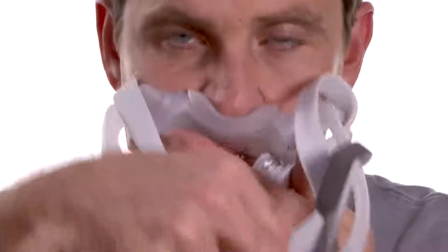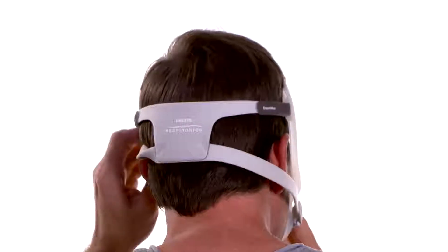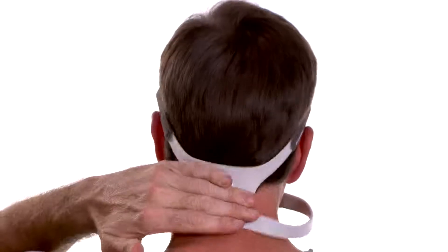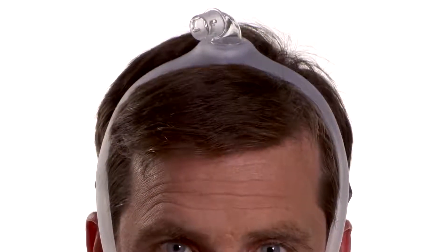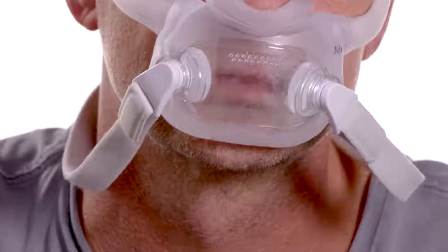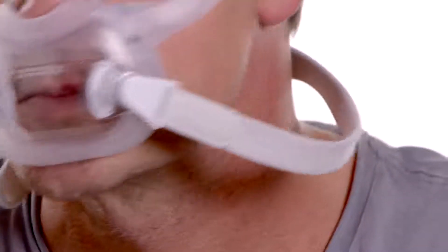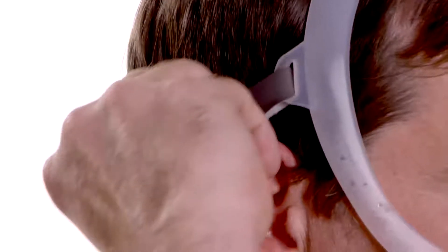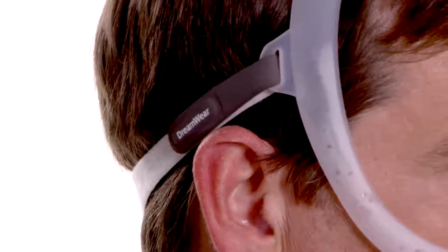To put the mask on, hold the cushion under your nose and pull the headgear down until it sits across the back of your head. Position the mask frame on the top of your head. Be sure the magnetic headgear clips are attached to the mask cushion. Peel the headgear tabs away from the fabric top strap and adjust the length of the top strap evenly to achieve a loose comfortable fit. Press the tabs back against the fabric to reattach.